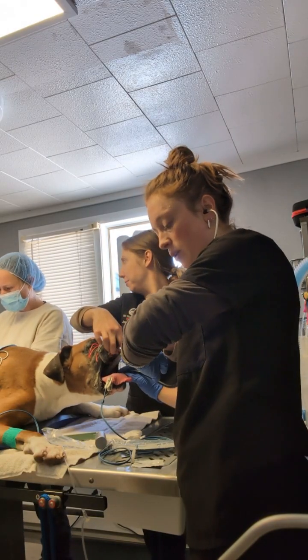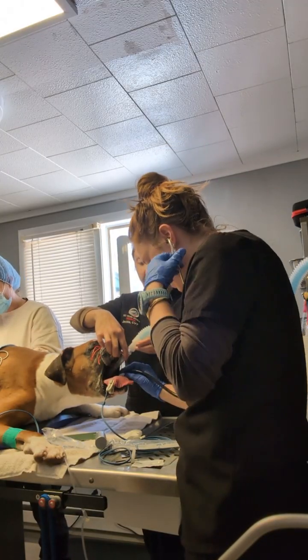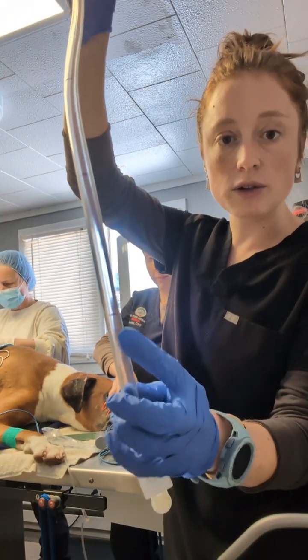Perfect. So I can hear the heartbeat. I know that's placed correctly, so I can monitor the heart patterns with that. And then for gastric intubation, we would just use a gastric tube, and there are some markings along the side that I can use to measure.